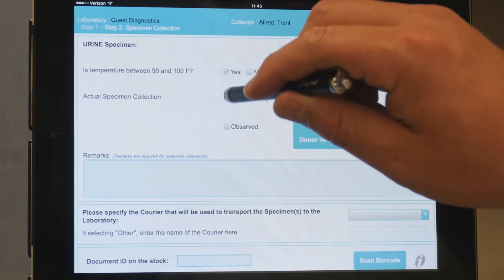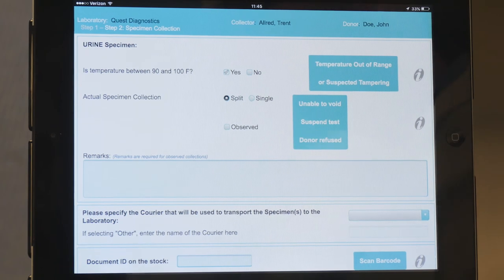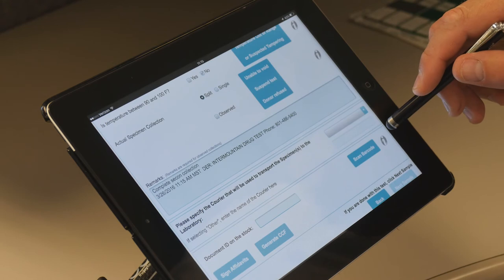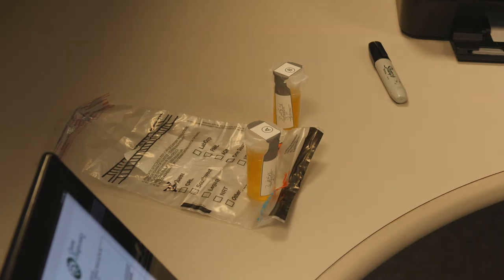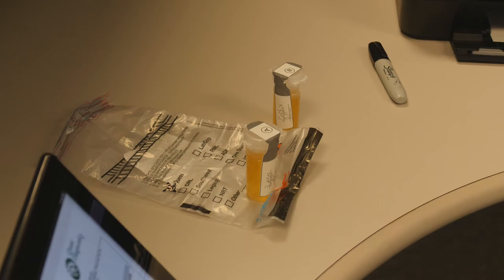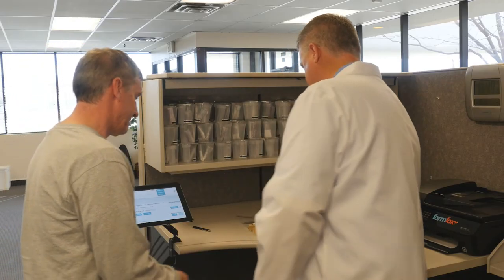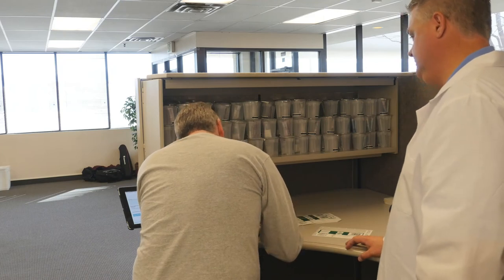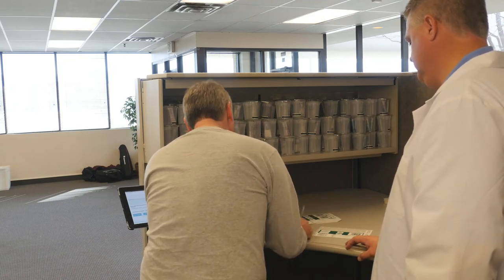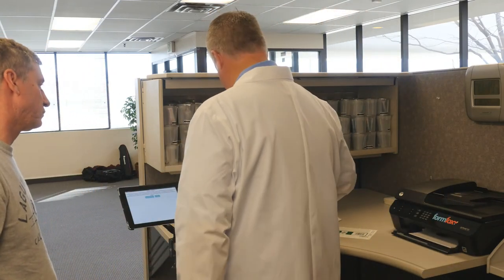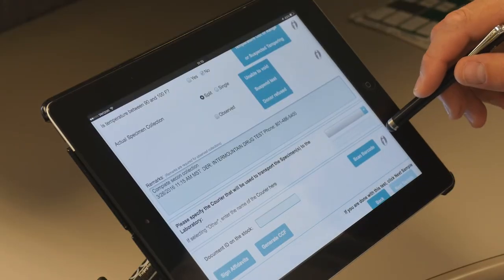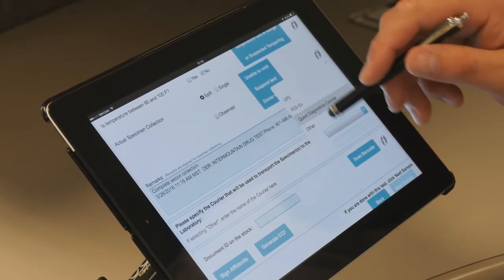If the collection is a split specimen, indicate by tapping the radio button. If the collection was observed, select the appropriate box. Select the courier that will be used for shipping the collection sample to the lab by tapping the down arrow on the right side of the drop-down menu. The donor must watch the collector pour the specimen from the collection container into the specimen bottle or bottles, and then the collector places the FormFox specimen ID on the specimen container, dates it, and has the donor initial the label. Discard unused FormFox labels or place on the outside of the specimen bag. The next step is to scan or enter the FormFox sample specimen ID into the FormFox collection screen from the specimen container seal.